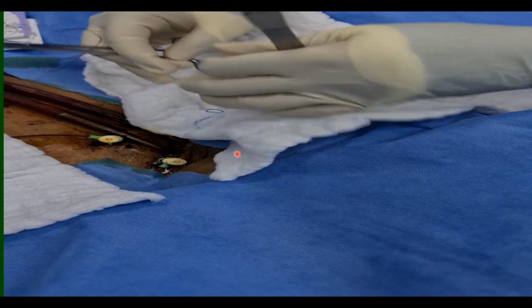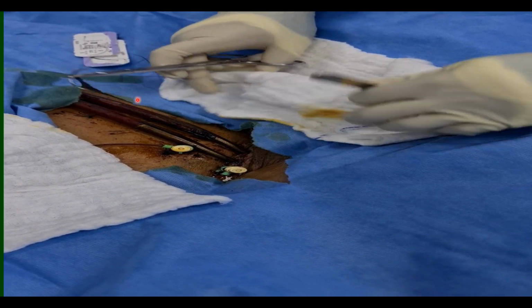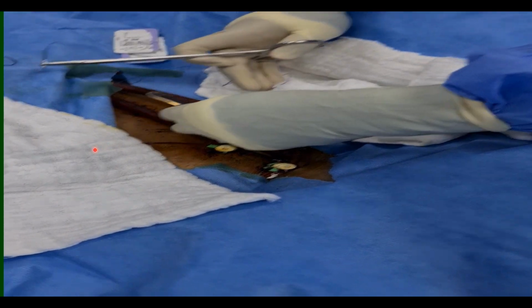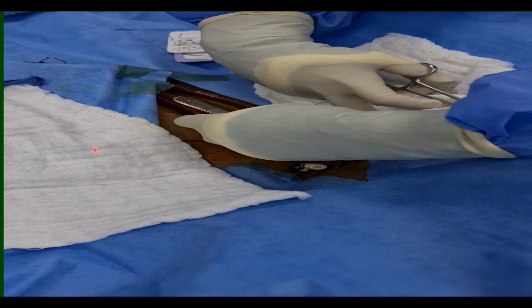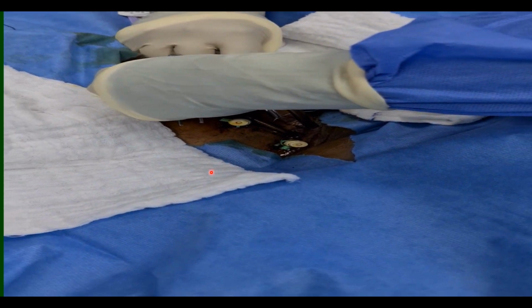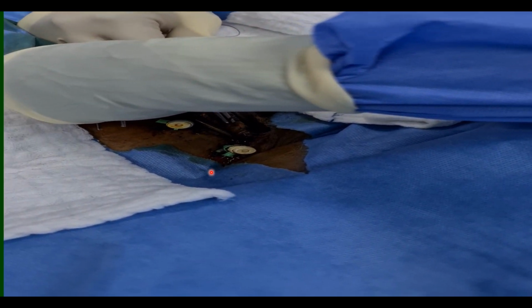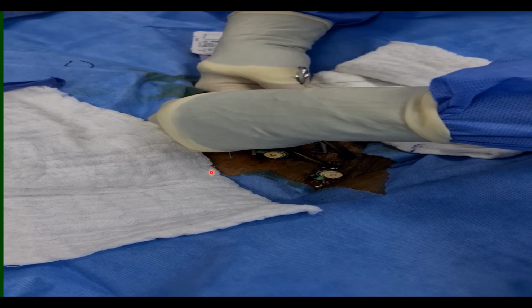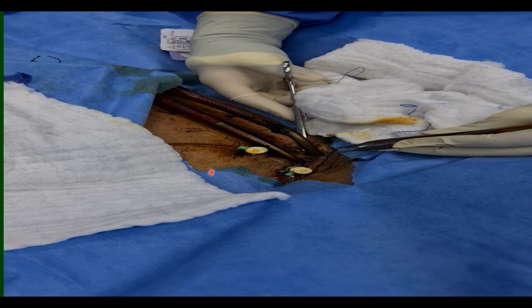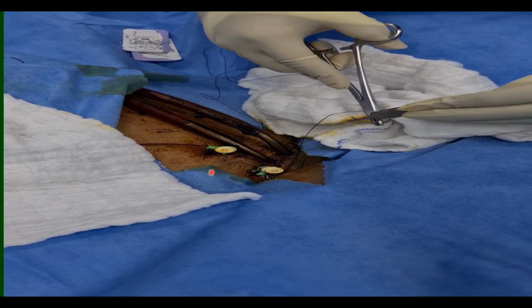In this case of VA ECMO decannulation, here we can see the venous cannula, the arterial cannula, and the reperfusion cannula. First, the patient has stopped anticoagulation, and we check ACT before the step of decannulation. The patient is on full sedation and muscle relaxant, and the ventilation and inotropic support are optimized.